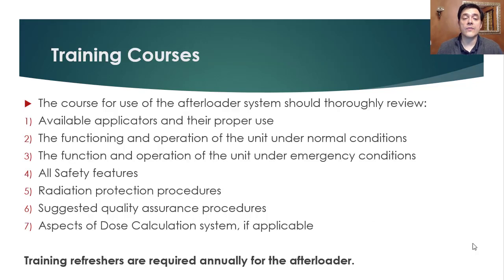Insofar as training, the course for the afterloader system should thoroughly review the available applicators and their proper use. So if you're going to be using the Savvy applicator, it's nice to have the rep come out and provide some insight into the measurement and the removal of the device. Number 2, the functioning and operation of the unit under normal conditions. I think that the vendors do a very fine job of making sure that there is normal use training. And number 3, the function and operation of the unit under emergency conditions.